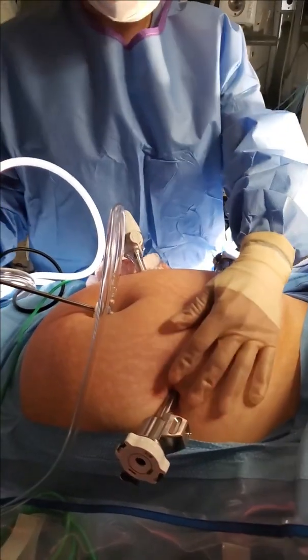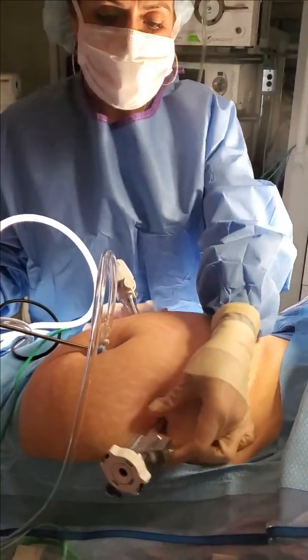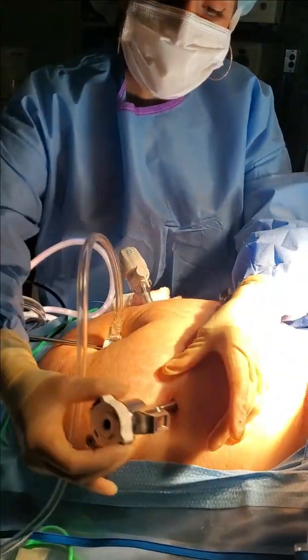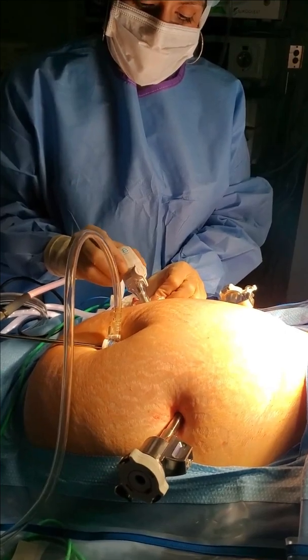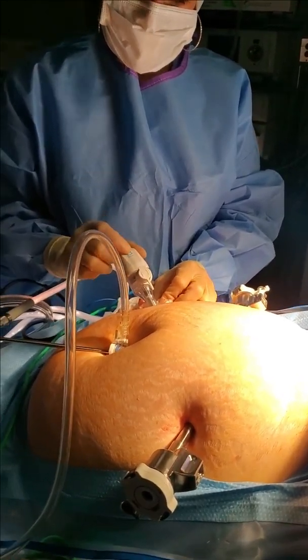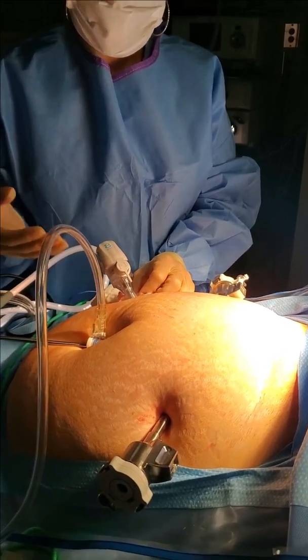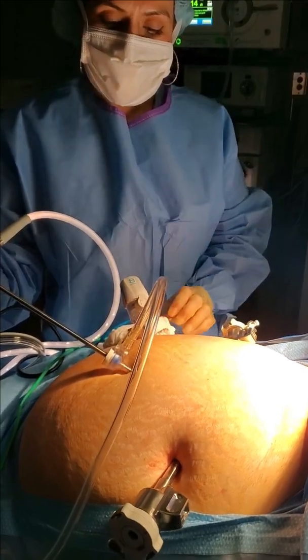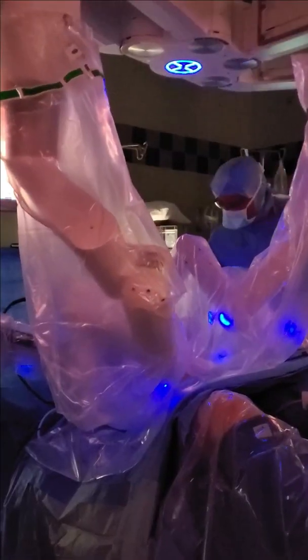This is the configuration we usually use for the robot. Those earlier arms that I showed you attach to this portion of the trocar, so this moves around with the arm. This trocar here is for my assistant — this is where they pass me sutures and instruments, and they also help me hold some of the tissue. And then this one here is for our camera.